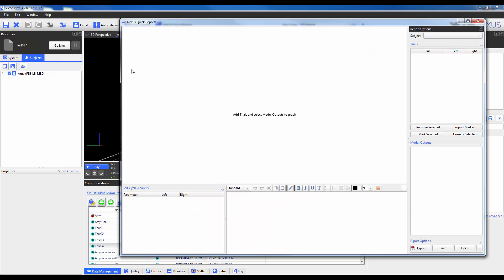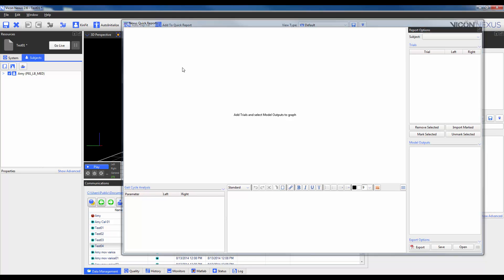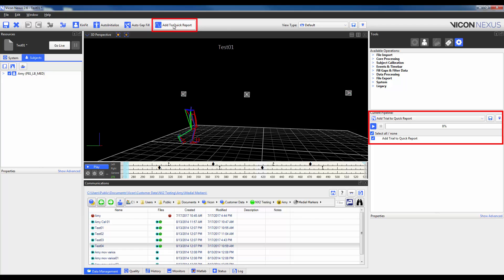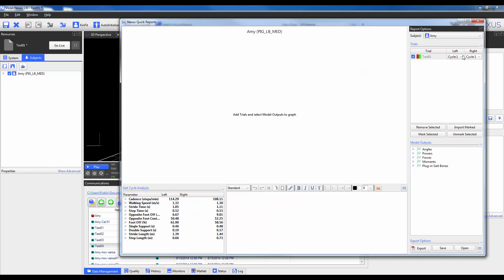By default quick reports will always be blank when you first open Nexus. To populate trials into quick reports there are a couple possible methods. The first one involves having a trial open and running the pipeline operation add trial to quick report. There is also a shortcut in the toolbar that will do this automatically for you. Once clicking on it and opening quick reports we will see that I have a trial populated. I will now remove this trial so that we can see how the other methods will also populate trials.